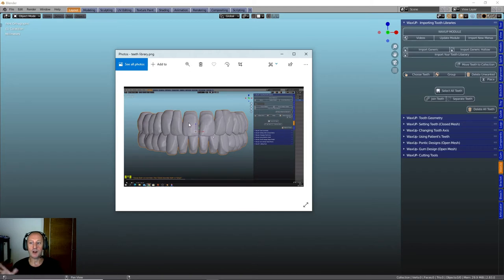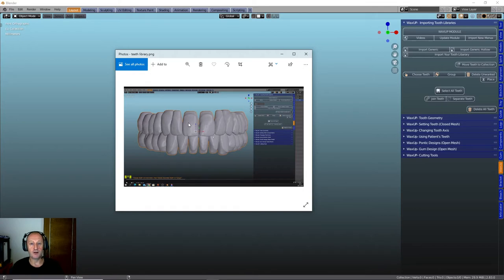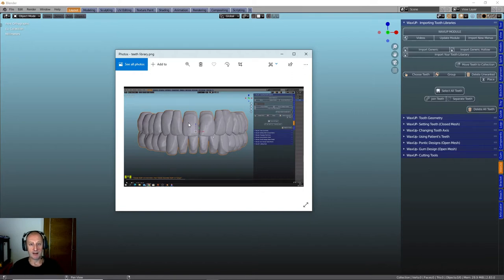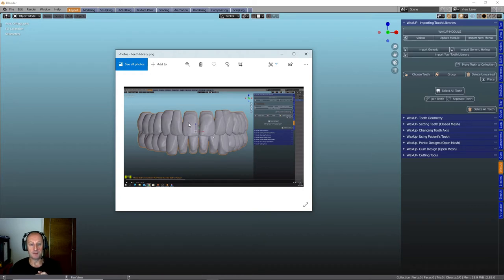These are the two. You can bring in any tooth library you have on the website Blender for Dental. There are some really nice tooth libraries for sale. People that have spent a lot of time crafting and putting together these libraries and you can go and buy them and put them in the module and use them.